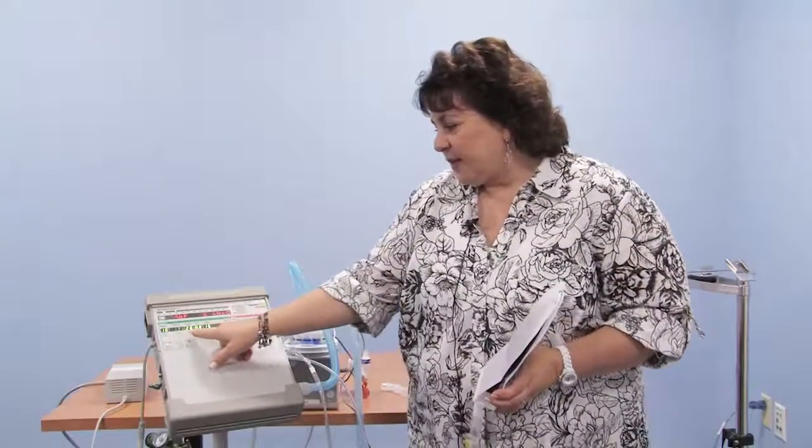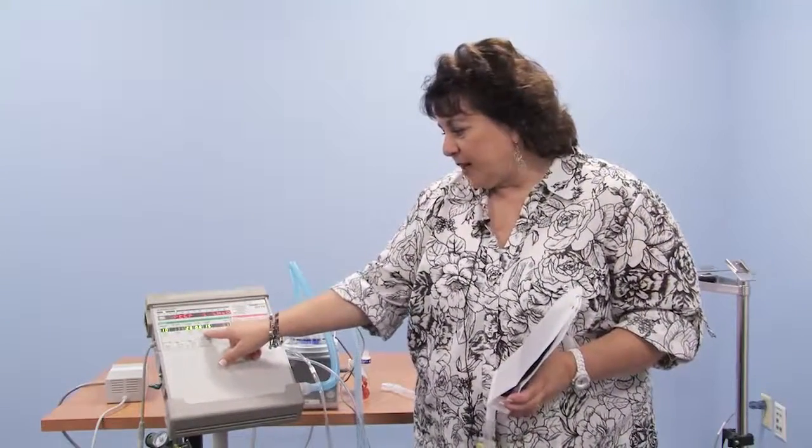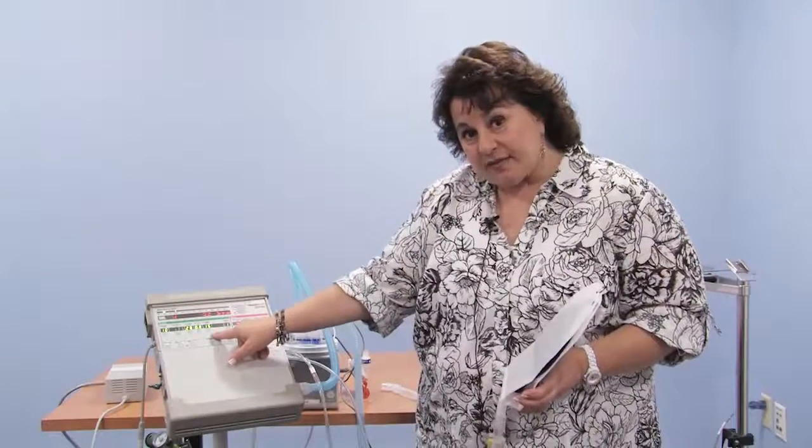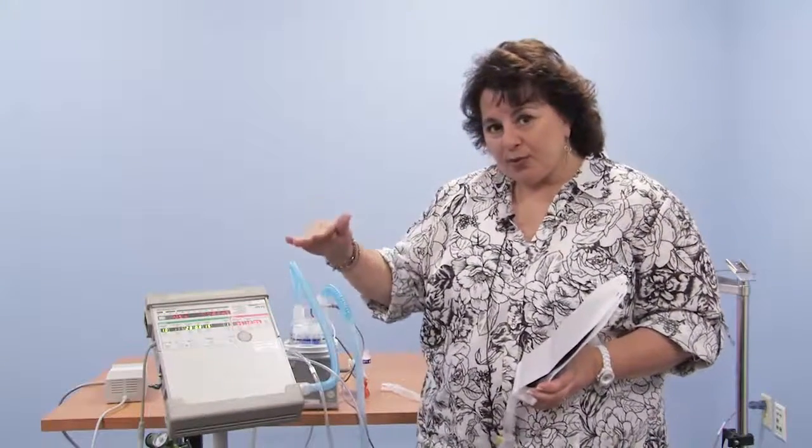So we have 10 breaths a minute. The breath goes up to 20, 0.8 seconds it holds for, and in between the breath inflates the lungs up to a pressure of 15. Now I keep saying up to, what's the down to? So PEEP, positive end expiratory pressure, sister to CPAP. CPAP is when you're breathing on your own. PEEP is when it's a machine breath delivered to you.